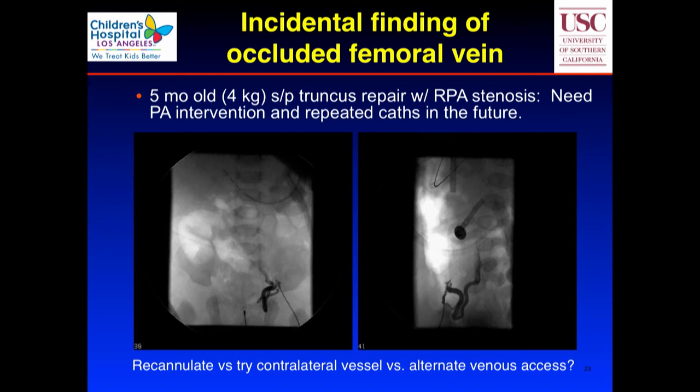Now just to show you, this is a 5-month-old baby who didn't really have a lot of symptoms. Now she had heart disease, but you can see how this vessel here on the lateral, the little beak there, that vessel doesn't go anywhere. But I know that when I take a picture there and I see that little tiny beak, I can get through that.